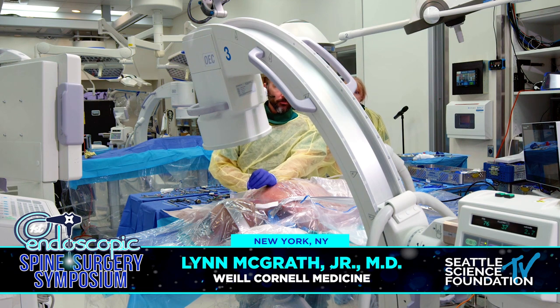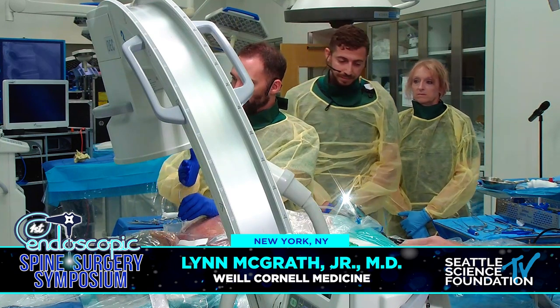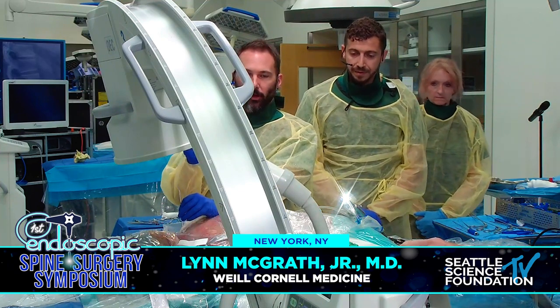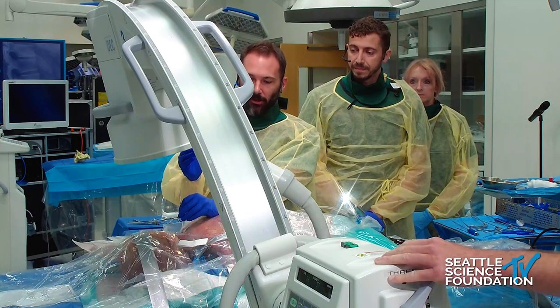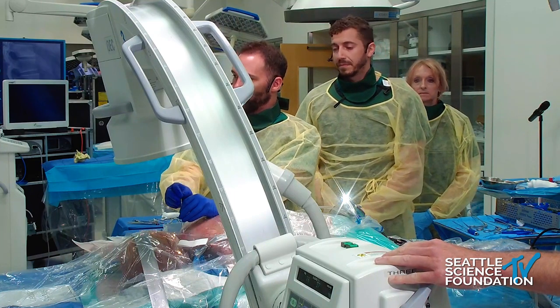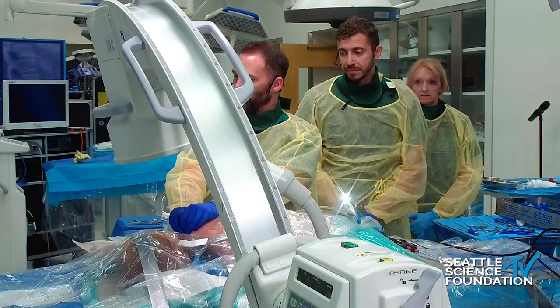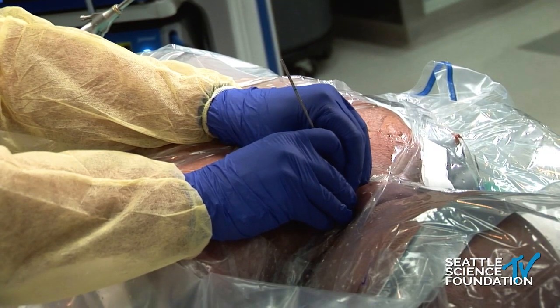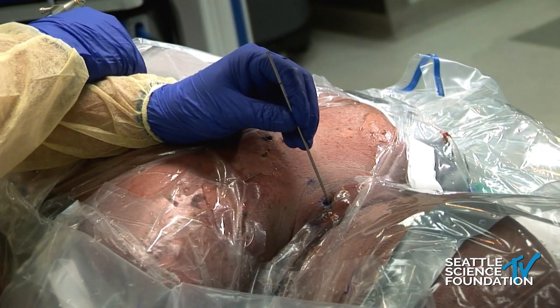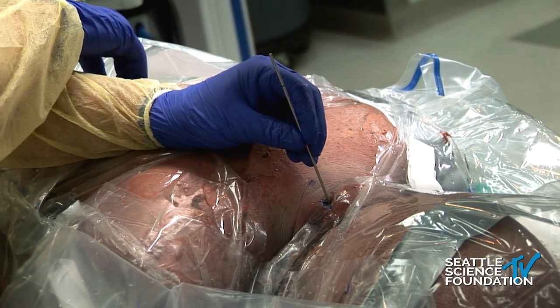There are certain landmarks that are universal to this approach. What I like to think about is converting this to the same sequence of steps I use for many other procedures. I'll do almost every case by starting on the inferior lip of the lamina of the target level. One of my first goals is to feel that familiar landmark, rubbing my initial dilator along the inferior lip of the superior lamina, then working my way out to the keyhole in the joint. I mention this because it plays into how I target things on x-ray. Before that, we'll just take a couple of shots.